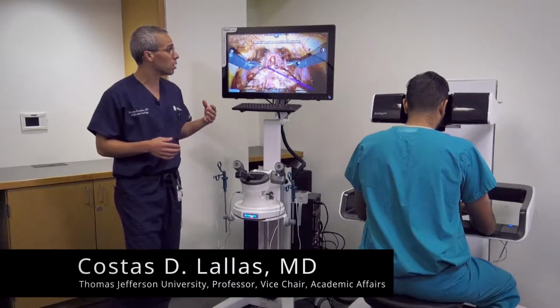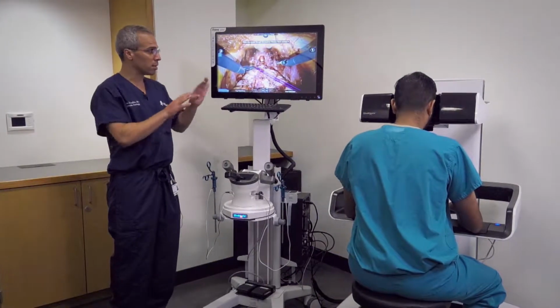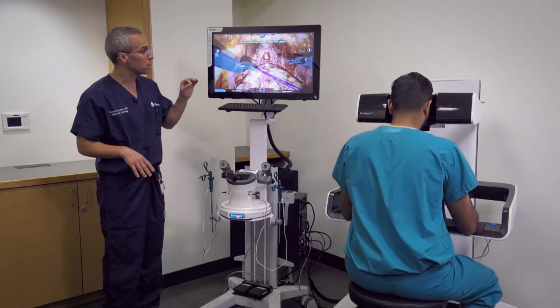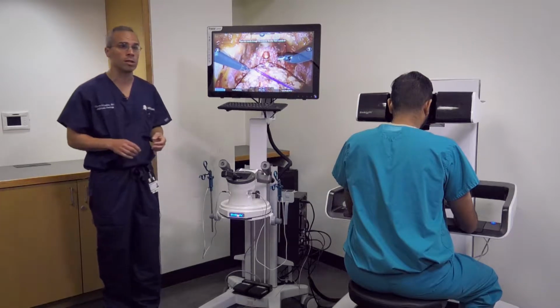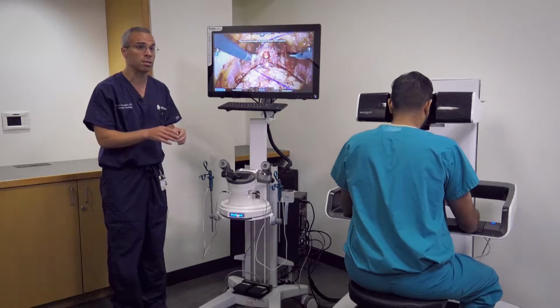This is the anastomotic model. So prostate's out. Now we're going to bring things back together again. And I have one of our chief residents here. This is Dr. Amar Rabal. So Amar, this is his sixth year of residency.